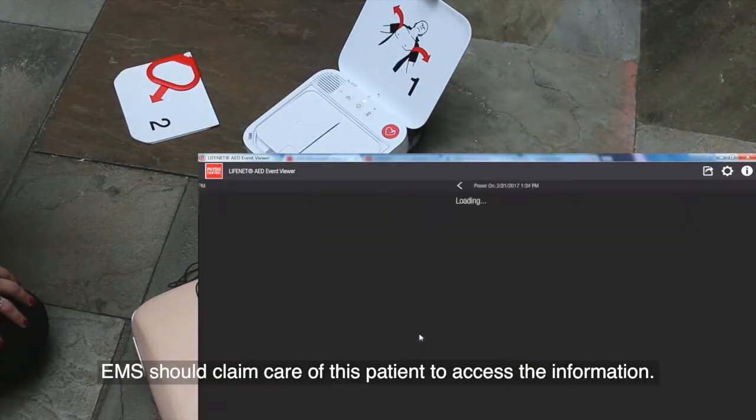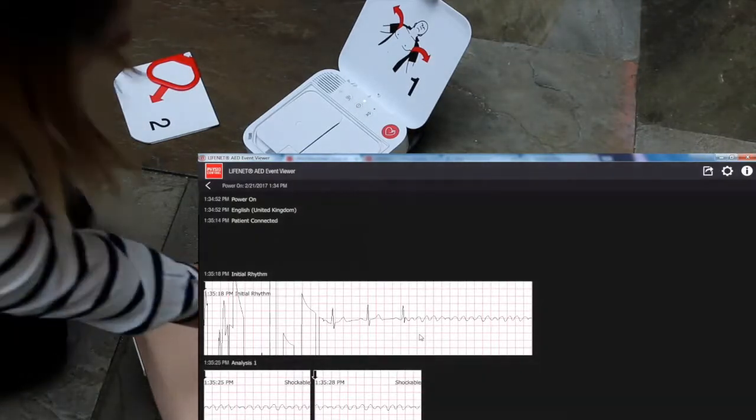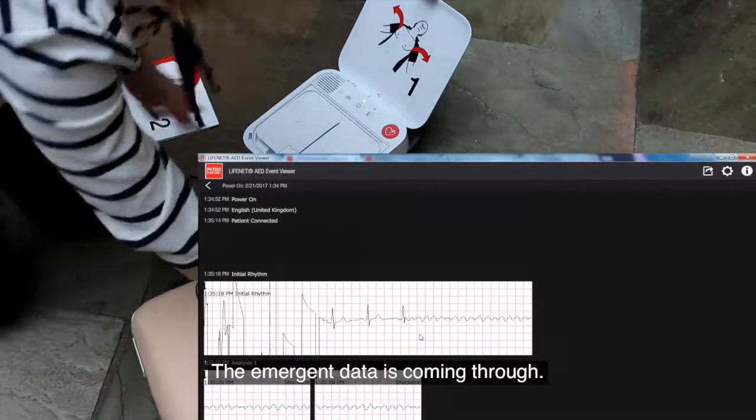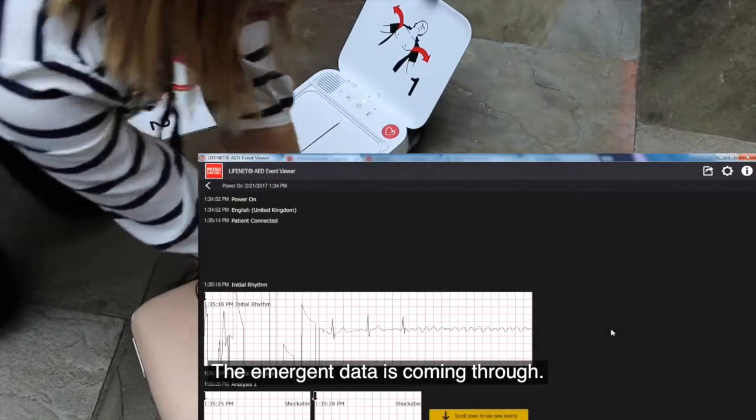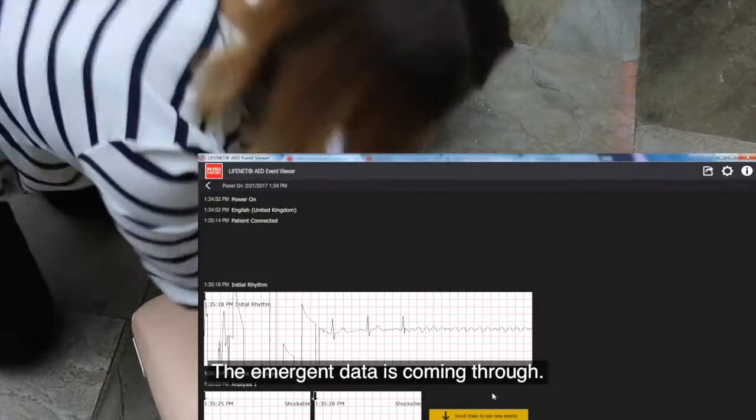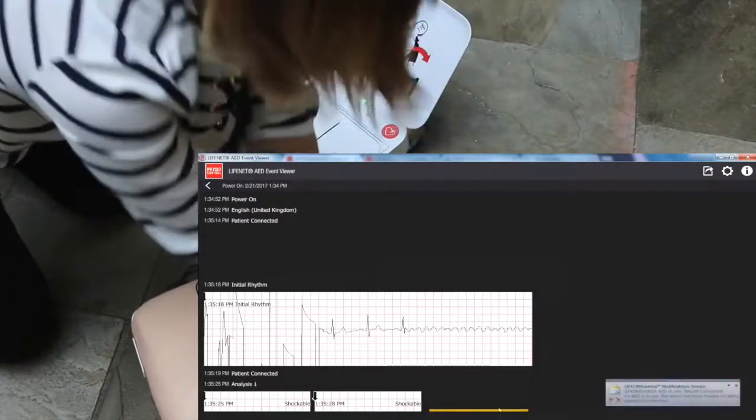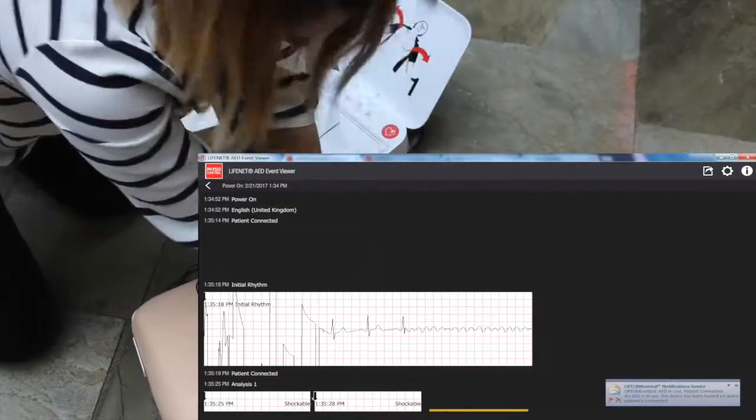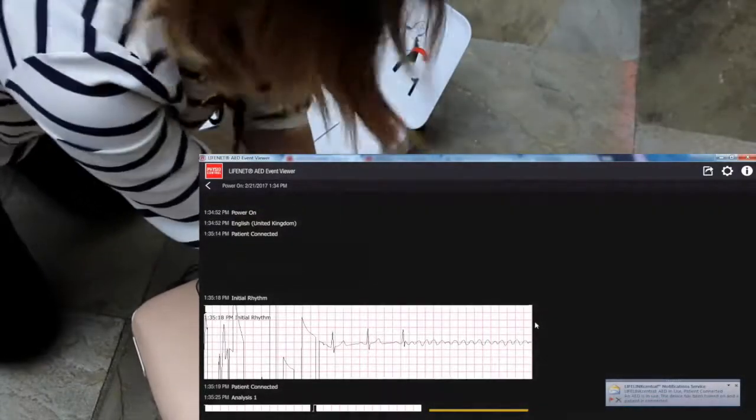Provide chest compressions to the beat. The heel of one hand should be in centre of chest. The other hand should be on top of first hand. Push down hard at least five centimetres.